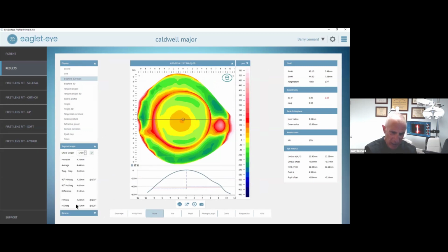I'll say, well, look, you have this much toricity, this much asymmetry, and just try to explain to them that Pringle shape to their eye. So it just works real well. So let's go back to our slideshow there, Gianni.